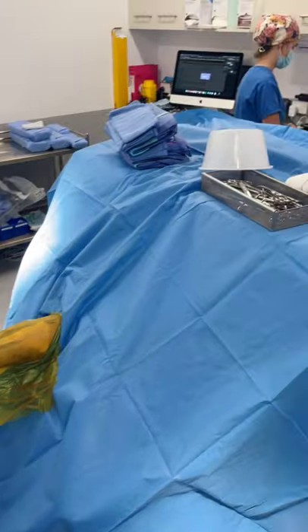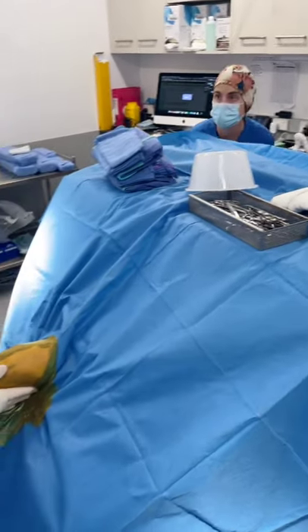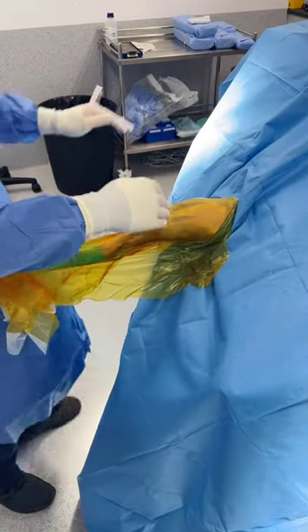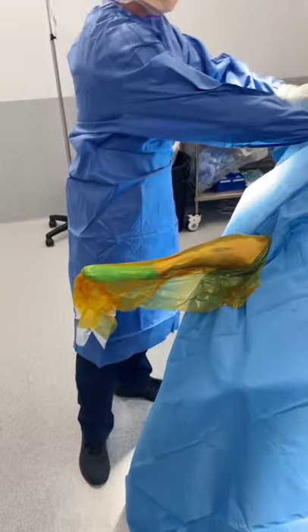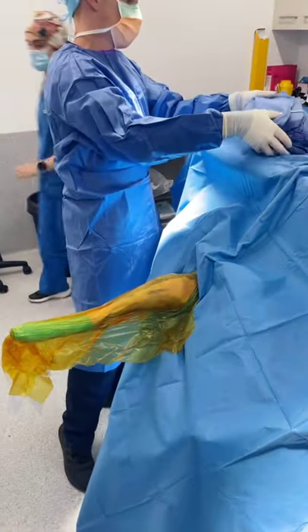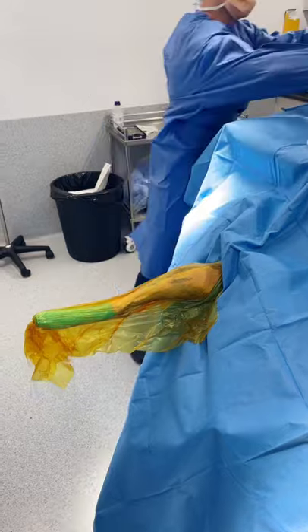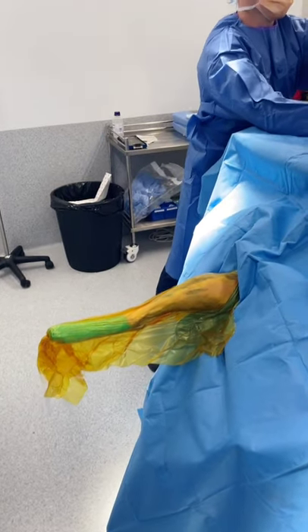That patient drape extends up onto the back table, which is over the dog, and then we can put all our instruments on top of that. So that is the preparation — that's how we get these guys ready for surgery. I thought that might be something a bit different and interesting for you, and give you some ideas for how you might prep your patients in your own surgery. Hope you have a good day — talk to you soon.